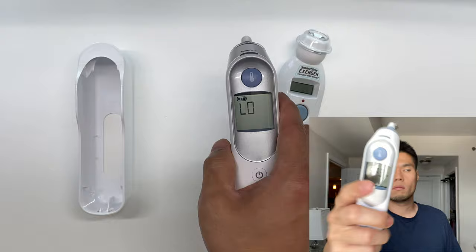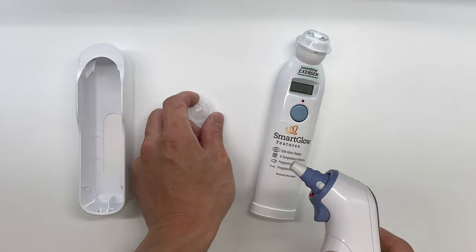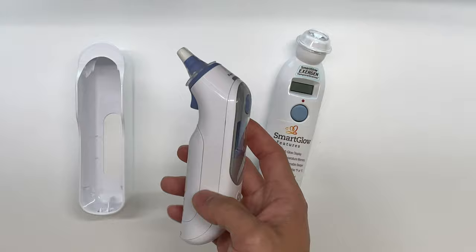One thing to note is you do have to replace these ear caps after each use. If I press this button it will discard this one, and then we would get a new one and put that on there. That's just for hygiene because ears have earwax and things like that, so you do want to note that you will have to replace these ear caps.